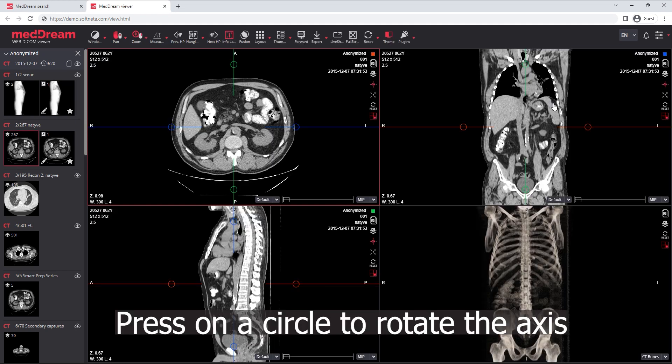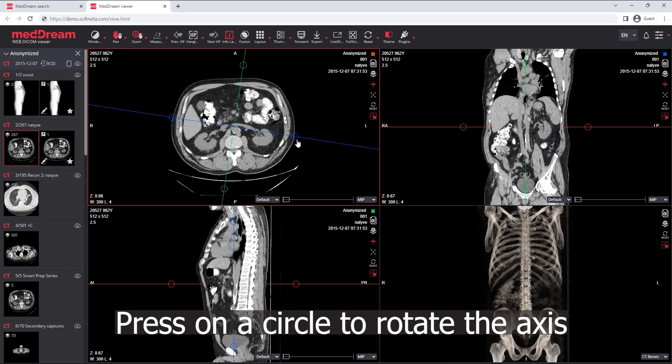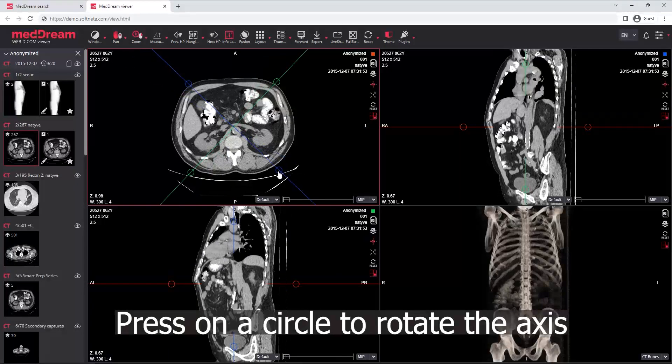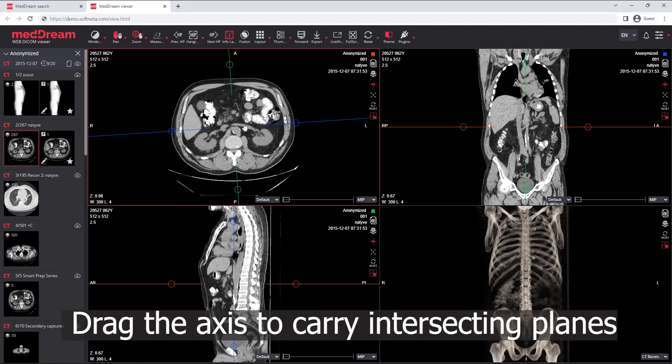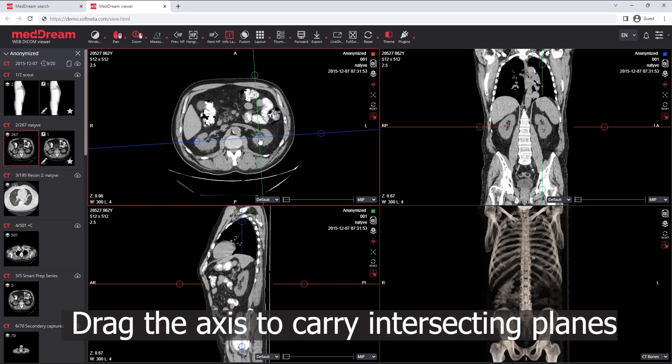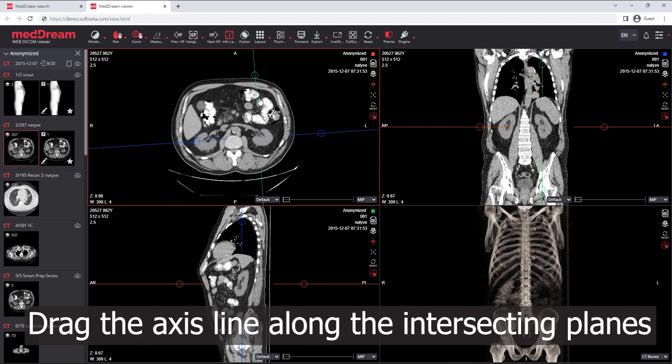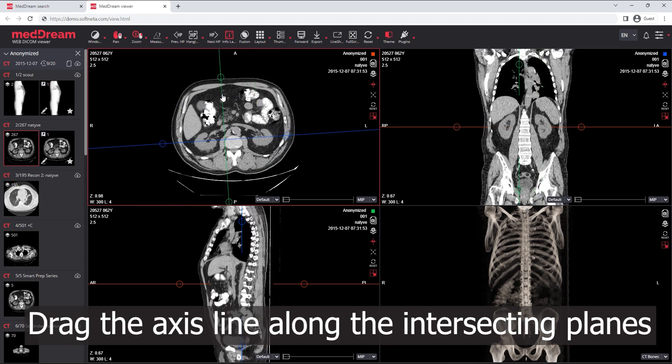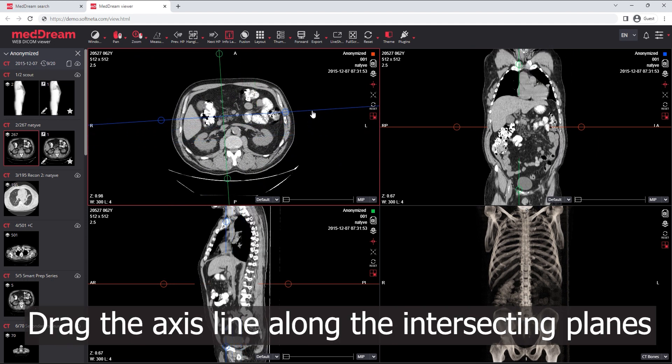Press and hold the left mouse button on a circle in order to rotate the axis. Drag the center of the axis to carry intersecting planes. Drag the axis line along the intersecting planes.